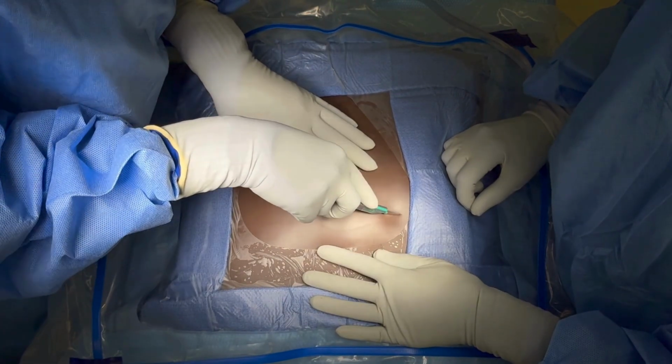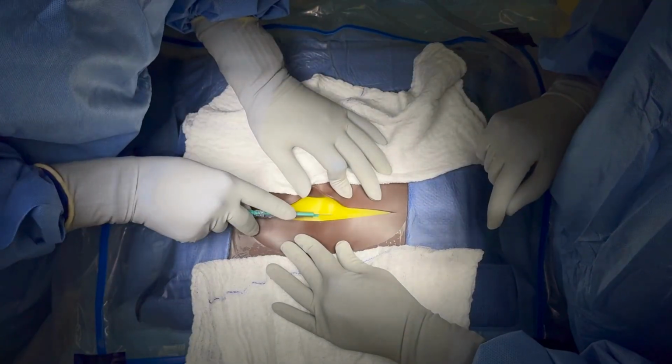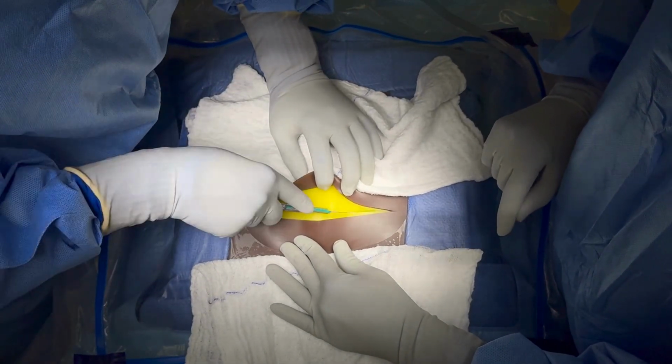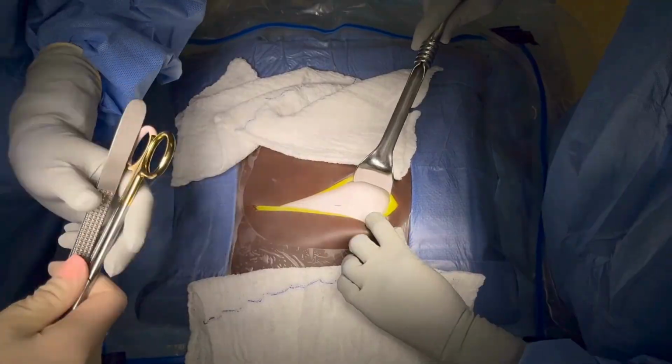A Pfannenstiel skin incision is made 3 centimeters above the pubic symphysis and extended laterally approximately 12 to 15 centimeters. Sharp dissection is then continued through the subcutaneous layer down to the fascia. The fascia is then incised sharply at the midline using the scalpel.